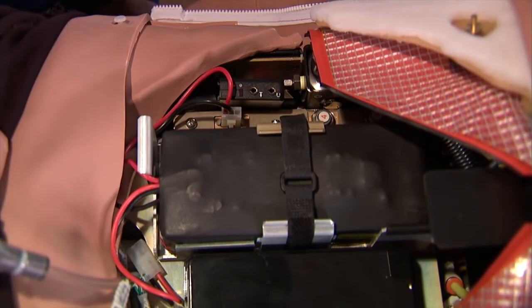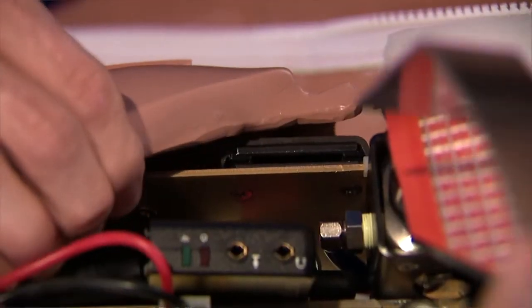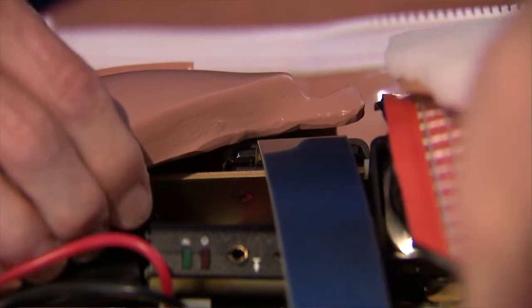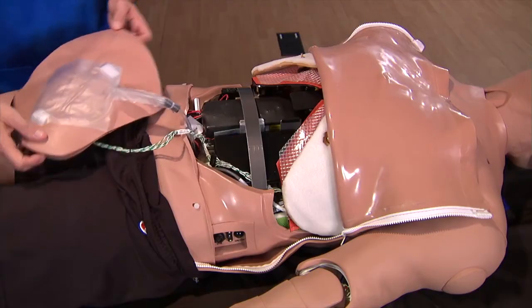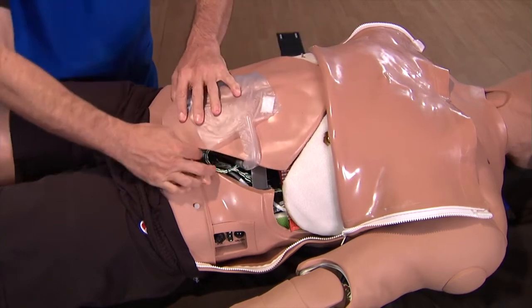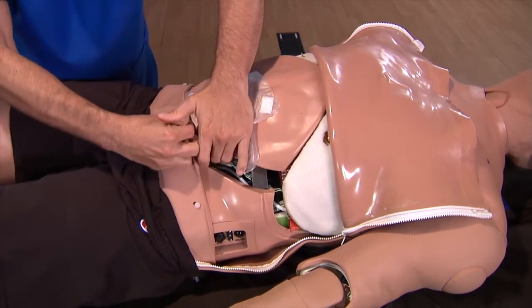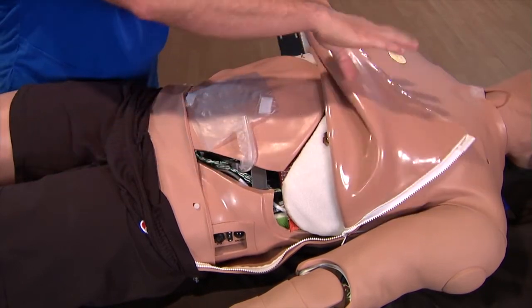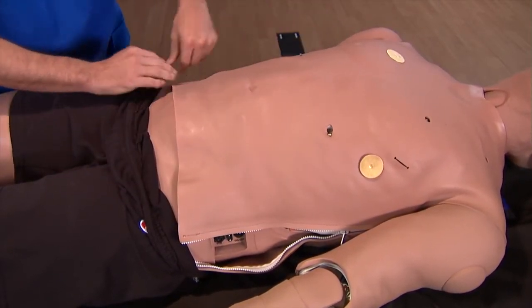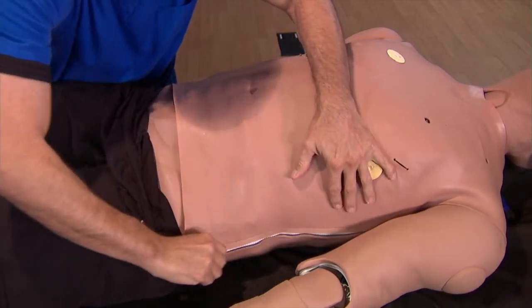Replace the abdominal support by inserting it into the slots. Tuck the tether up under the wall of the abdomen and replace the abdominal insert. Fold the skin back over the abdomen and zip up both sides. Pull the shorts back into place.